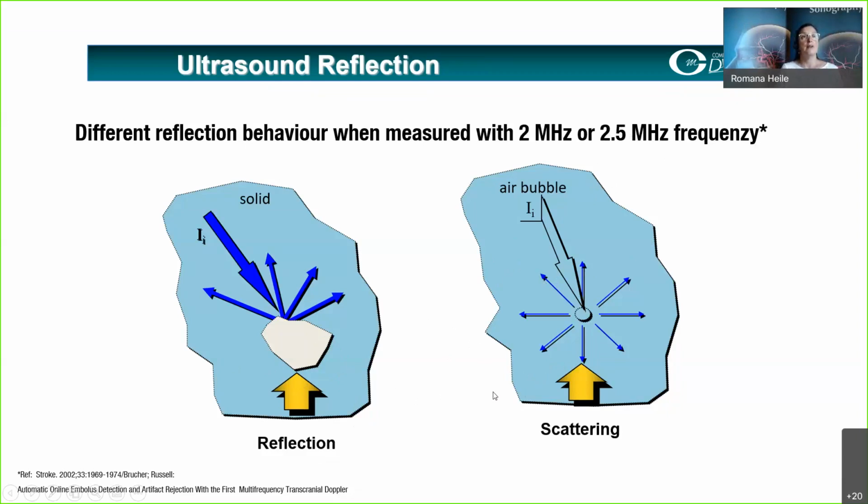If you want to know more about the algorithm of the multi-frequency insonation for the differentiation, then you can have a look at the validation article of this paper.